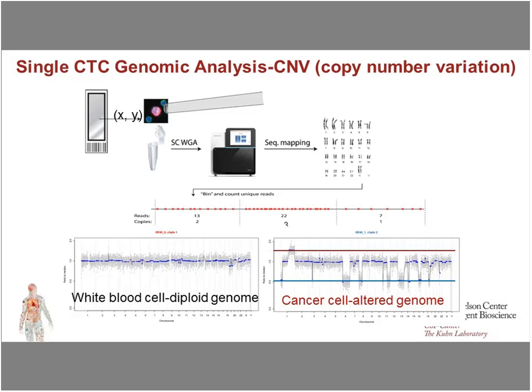And the right one is a typical single breast cancer cell, showing amplifications on chromosome 1q and deletions on a lot of other chromosomes like 6p, 8p, etc. Since all of this information was obtained and calculated at the single-cell level, which in theory all originated from 2 copies of the genome, we are able to calculate the stepwise alterations here.